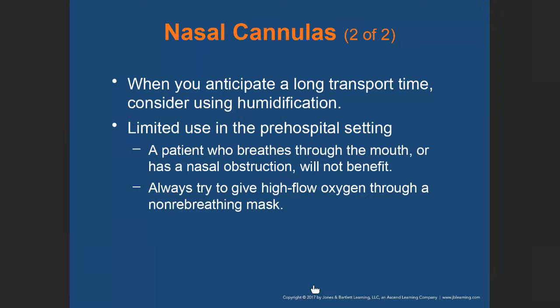And the reason for that is mobility. It's an environment that is very dynamic, and we have to move around and move things around. And no matter how much you tell people, don't go close to that cylinder, somebody's going to bounce against the cylinder. And if it drops and the stem cracks, you have a missile if it's a full cylinder. Right? So for safety purposes, if we're going to keep the humidifier on the unit, which is commonly done in Jamaica, it needs to be kept clean. Must be kept clean. If it's not being kept clean, you're introducing all types of organisms into the patient's lungs. Okay.